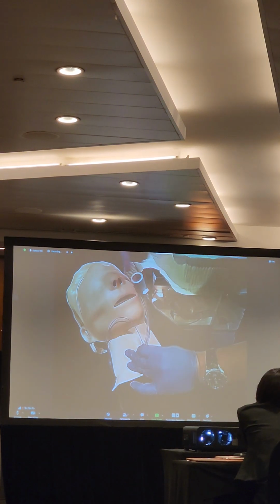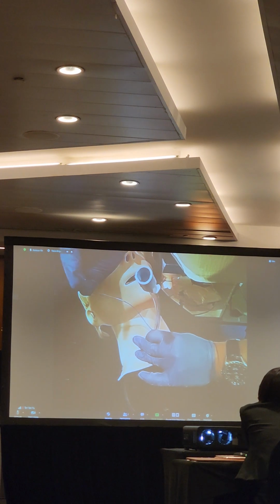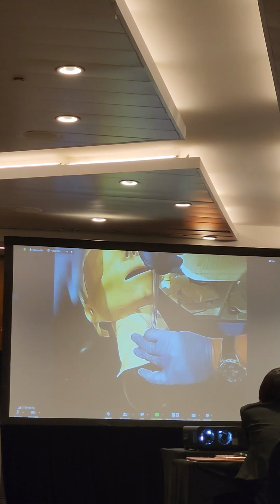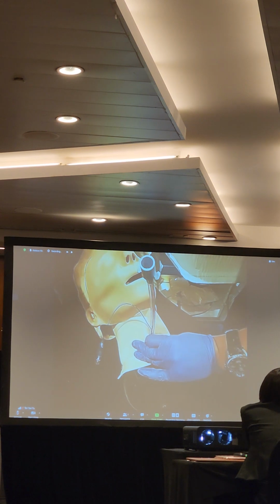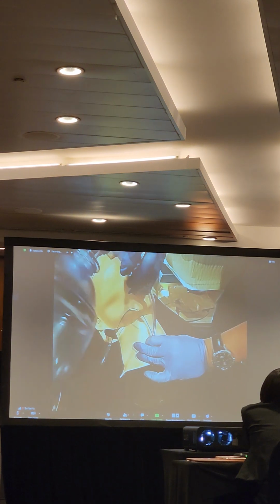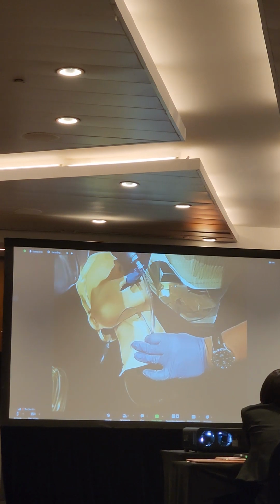Okay? And now we'll cuff up the ETT, and then we'll hook up the bag valve mask, capnography as well, and then we will begin a few series of checks. At this point in time, the ETT is still not secure, so you have to be very, very careful. Someone has to hold on to the ETT at all times.